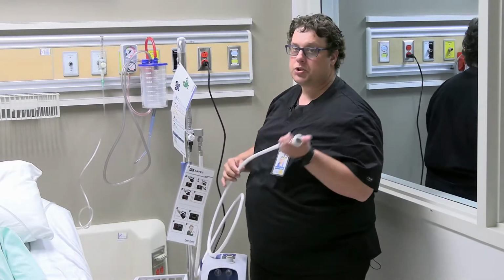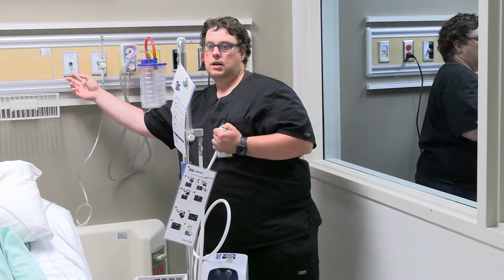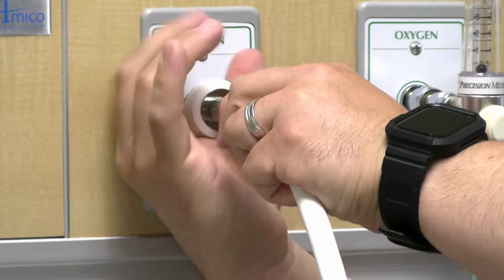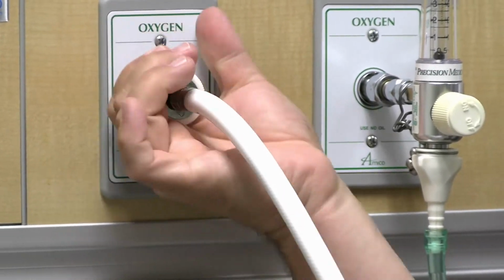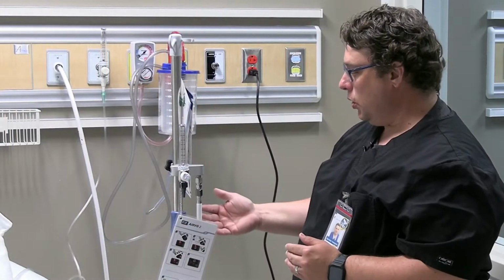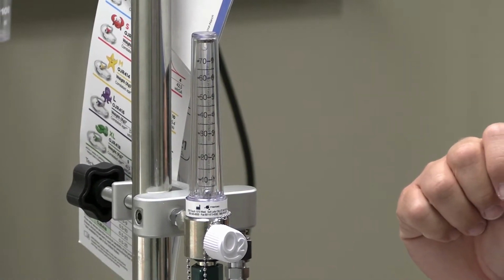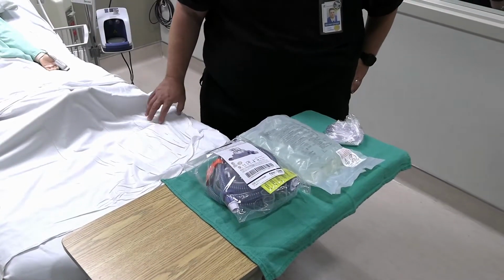We're going to take our high pressure oxygen tubing and we are going to connect it into the wall at our oxygen wall outlet here. This is a DISS connection, so this will only fit on your oxygen wall outlet. Okay, and you'll hear a little bit of a high pressure flow of gas until that is tightened on there, just like that. With the high pressure hosing, we actually have it attached to a little manifold here with an oxygen flow meter here. This is where you are going to dial your FiO2 percentage in order to deliver specific FiO2 to your patient.